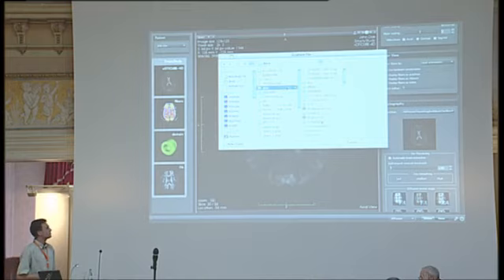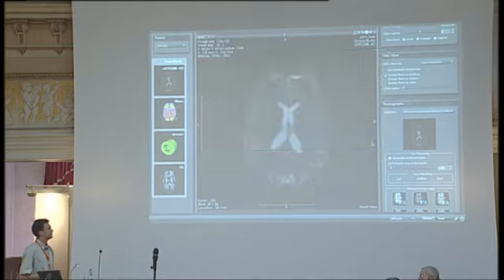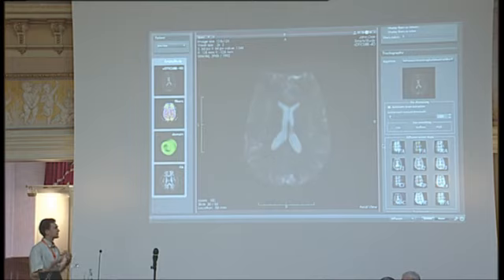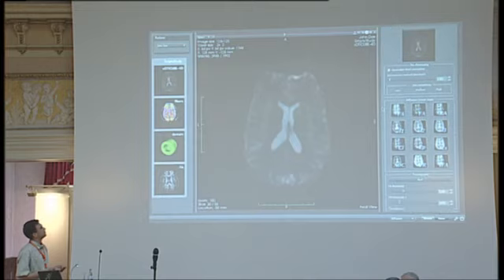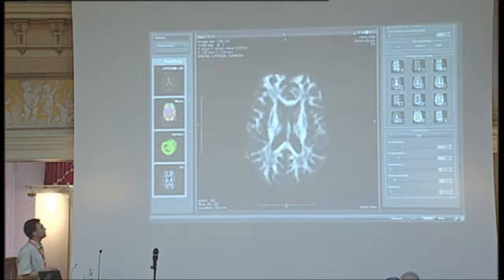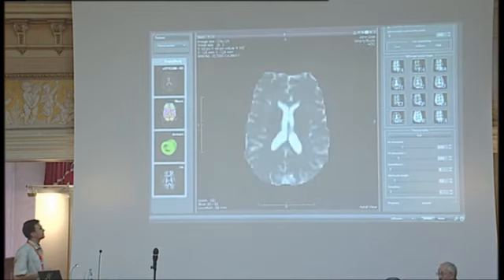You can already see the toolbox that is going to come up next, which is the one to construct scalar maps from the diffusion tensors. And when you click on one of those buttons, it's going to estimate the tensors. If it's not done yet, it's going to mask the brain. And I don't know why it's not moving anymore. And yes. Once you have done this, at the end, it's computing the scalar map and it's displaying it.